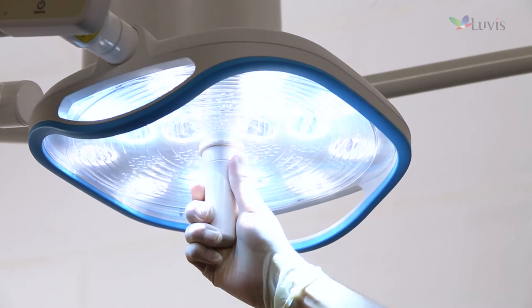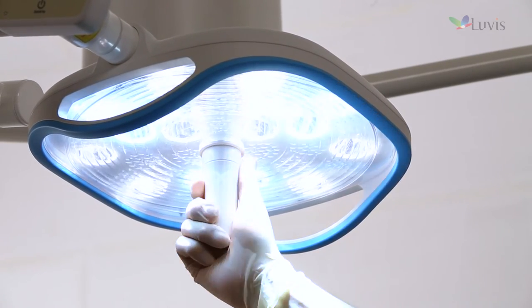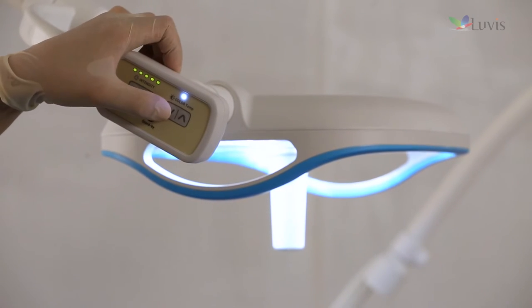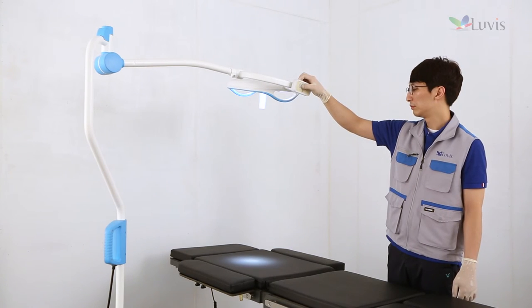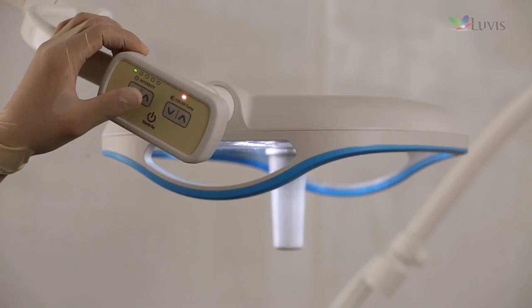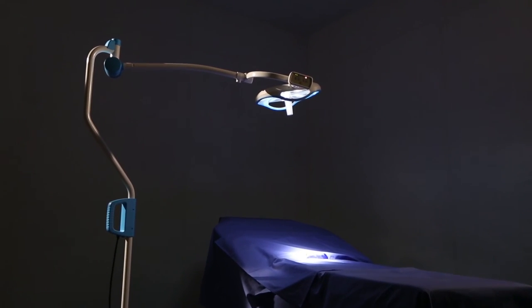Check for any problems with the inspection pattern while turning the focus control knob. Press the up-down control button on the control switch and verify there is no problem with the 3-step color temperature settings. Press the up-down control button again and verify the 5-step illumination settings. Installation is completed.